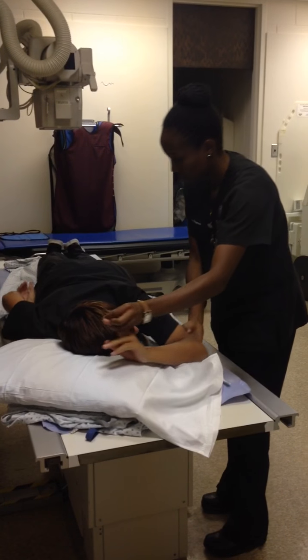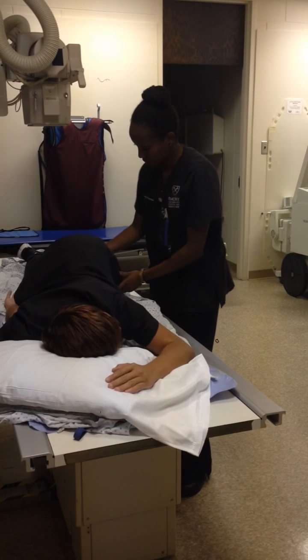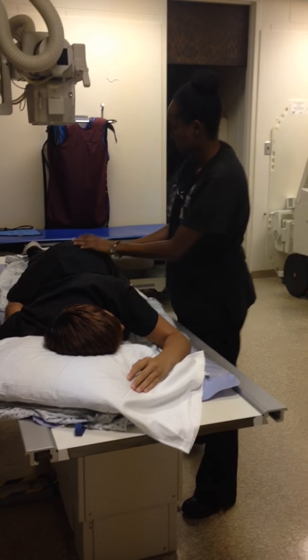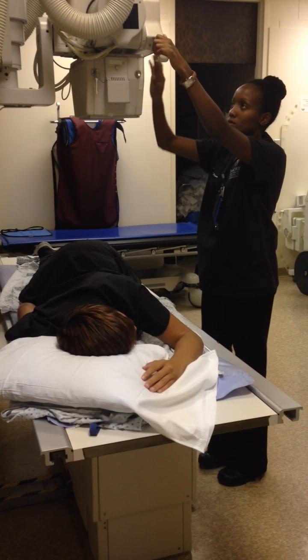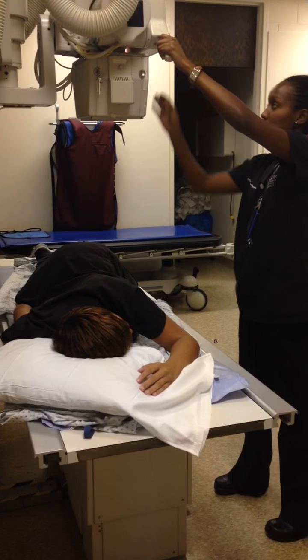Next, flex the patient's legs to help support the 35 to 40 degree rotation into an RAO position. Note, if the patient is smaller, you will need to rotate them more. For a larger patient, adequate rotation is less. Then, have the patient turn their head to their left to allow ingestion of the barium while obtaining images.